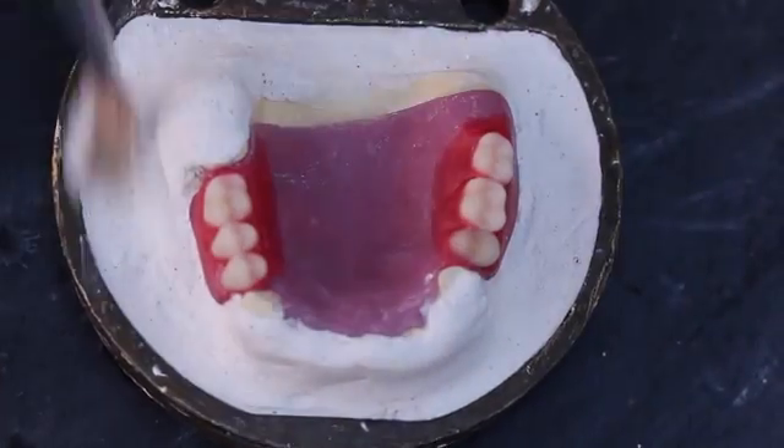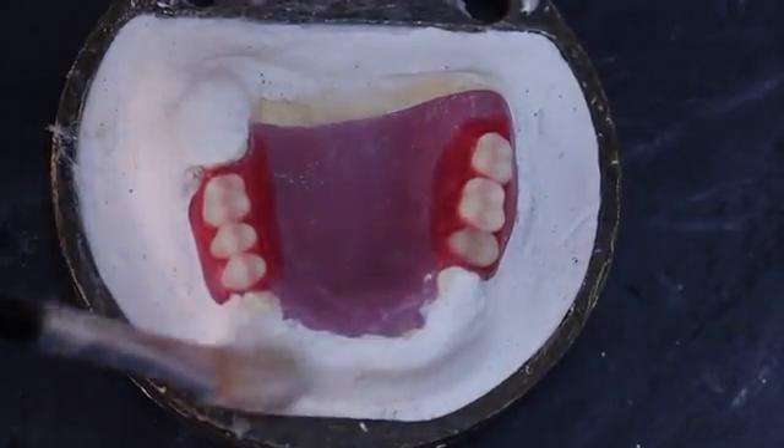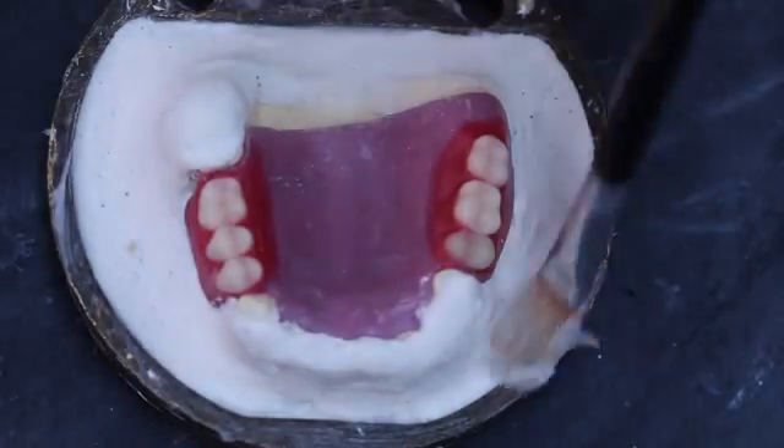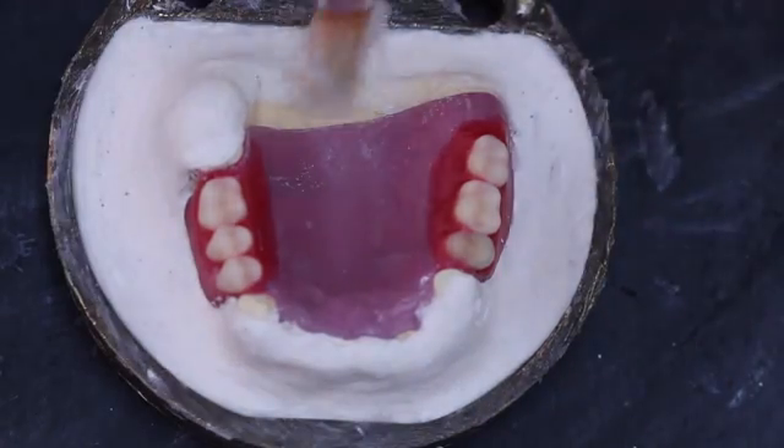After the final set of the first investment layer, a gypsum separating medium — in this case petroleum jelly — is painted onto all exposed stone surfaces.